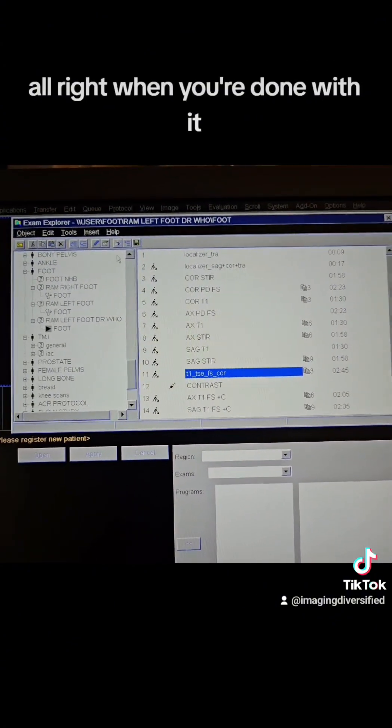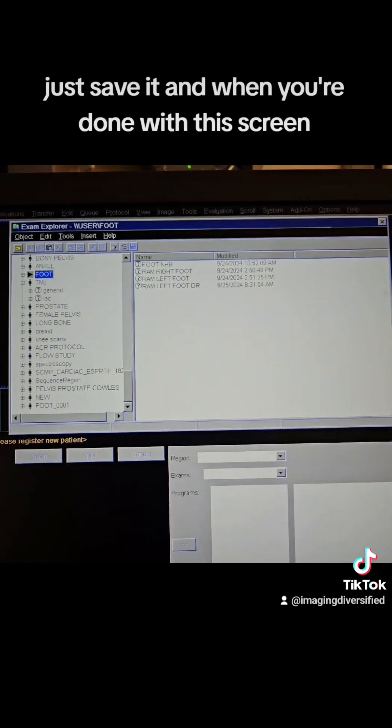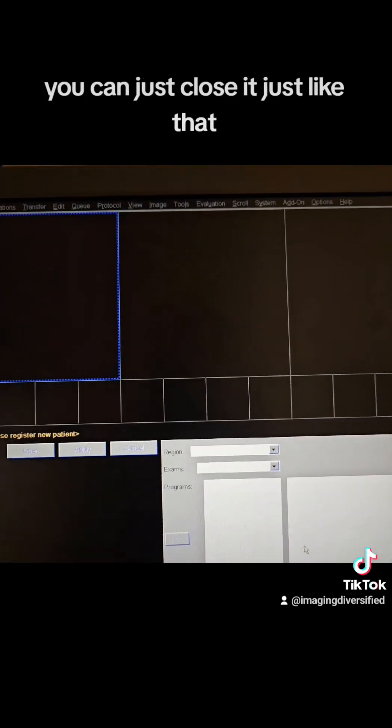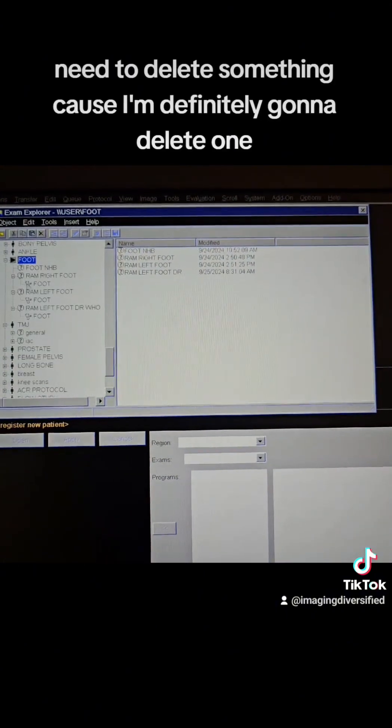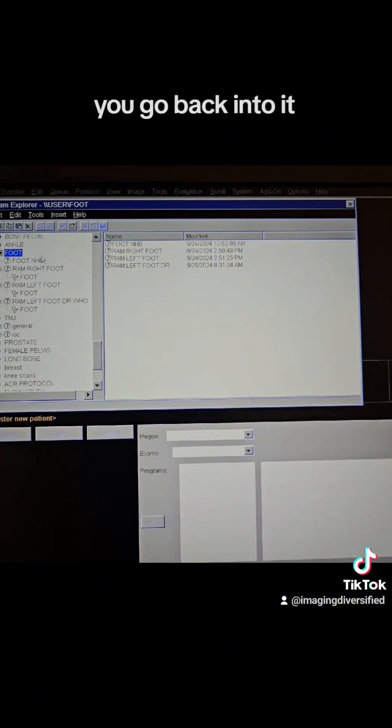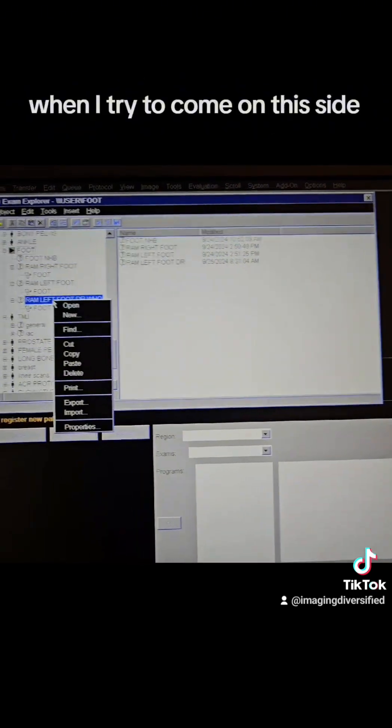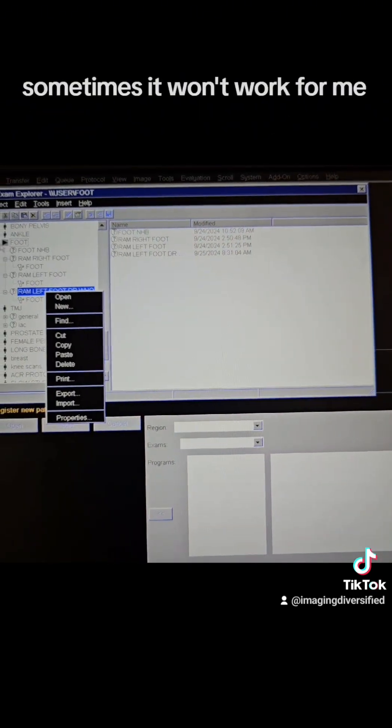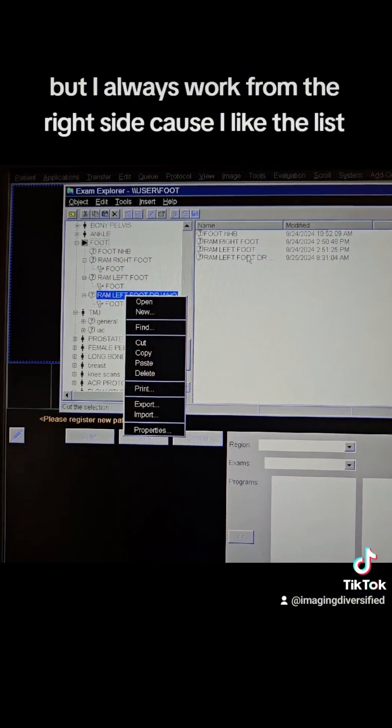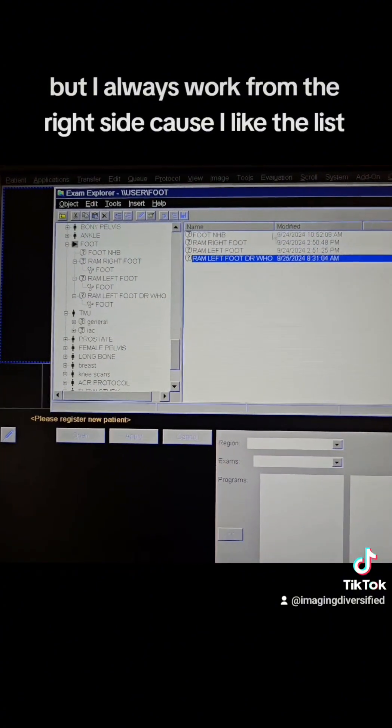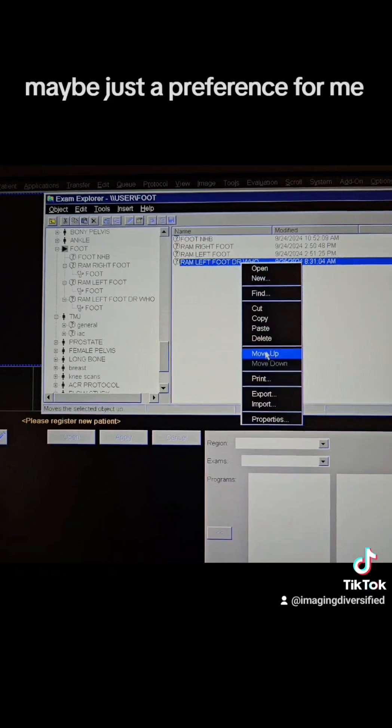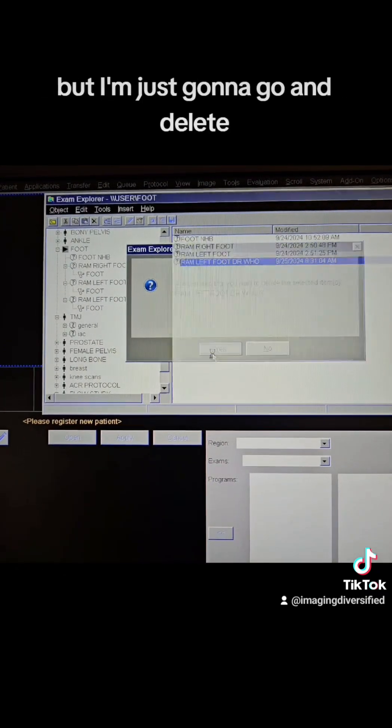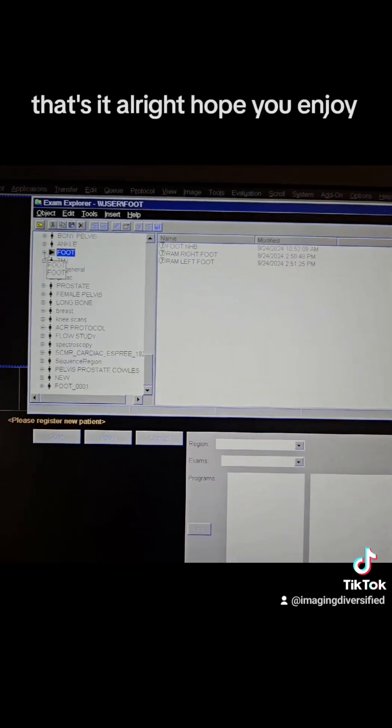All right. When you're done with it, just save it and when you're done with this screen, you can just close it. Just like that. You need to delete something because I'm definitely going to delete one. You go back into it, you find the level and you always work from over here to delete. When I try to come on this side, sometimes it won't work for me. This is fine. Just do a delete on this side, but I always work from the right side because I like the list. It's maybe just a preference for me, but I'm just going to go and delete. And that's it. All right. Hope you enjoy it. Peace.